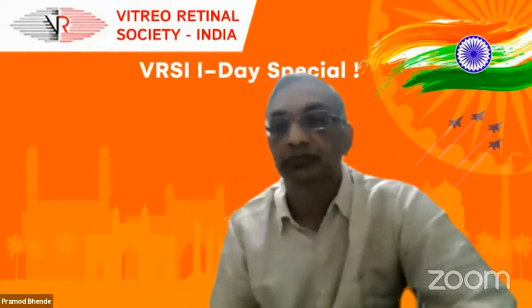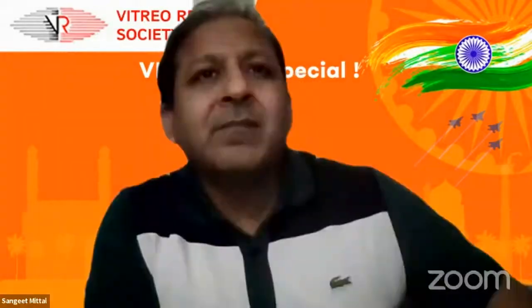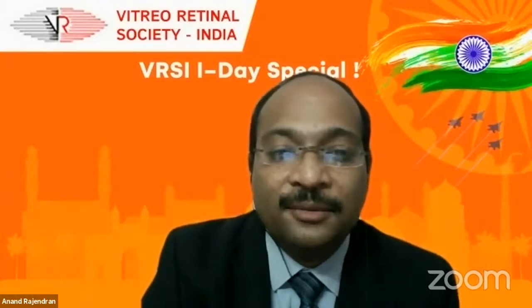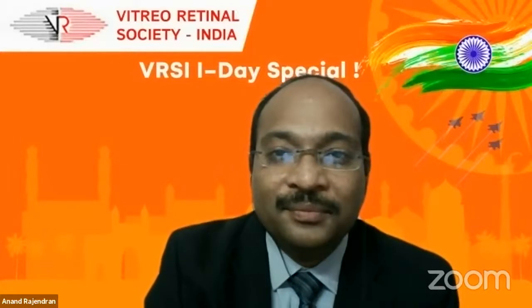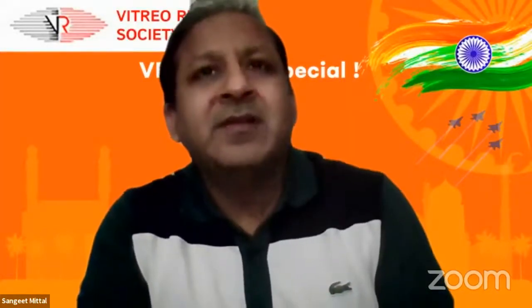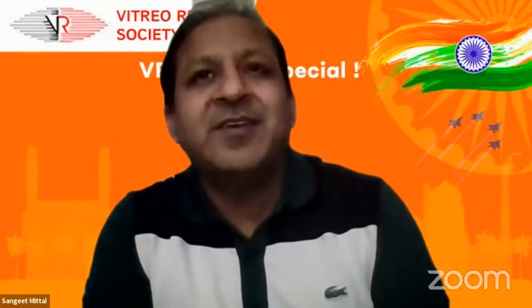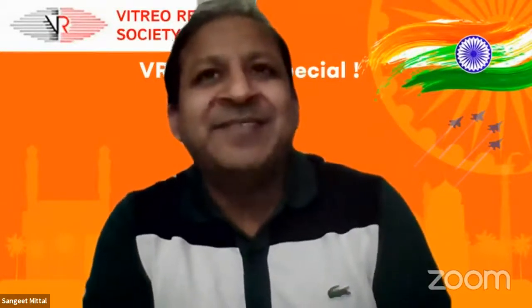Absolutely. Yeah, I agree. So there's a question also: how about using tissue glue instead of an ILM flap in cases of these kinds of staphyloma breaks? This is from Dr. Ajay Kapoor, Bhatinda. Dr. Mudit Tyagi has presented using tissue glue for retinal detachment. I think it's a very good idea, if it works. I've not tried it myself.